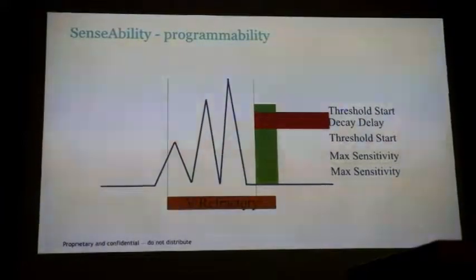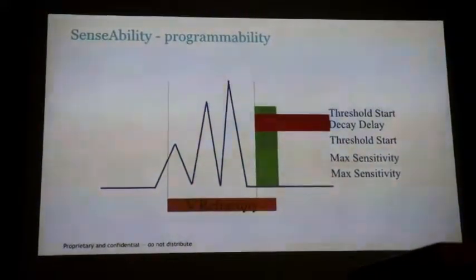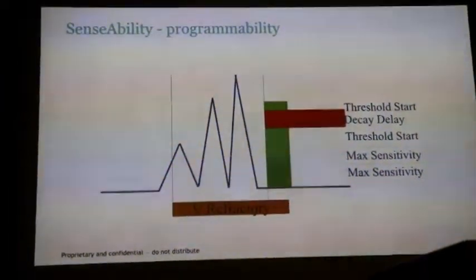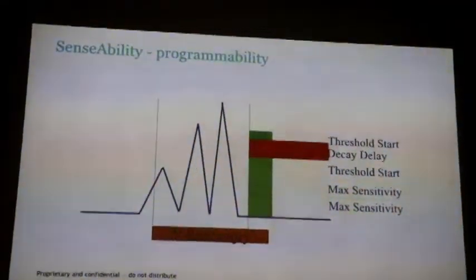So you never make these changes at implant. We say, doctor, please move the lead, get a better signal. Because if it's very wide, it's probably not a great signal, so we want a sharper signal. This here, you might change. Max sensitivity, you may change. You sometimes might use that if you've got T-wave oversensing, but in our device, not normally.